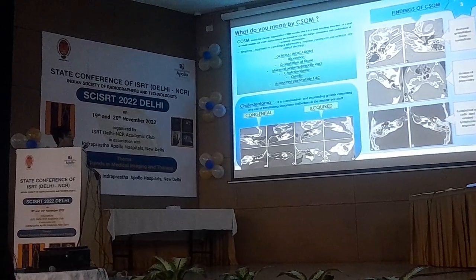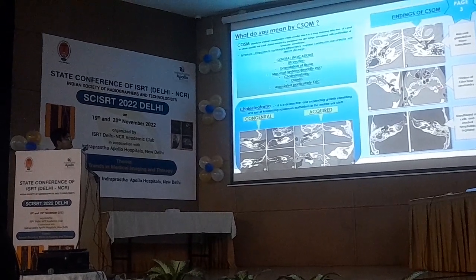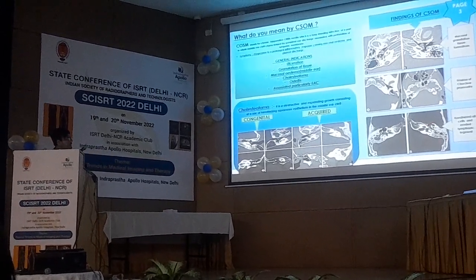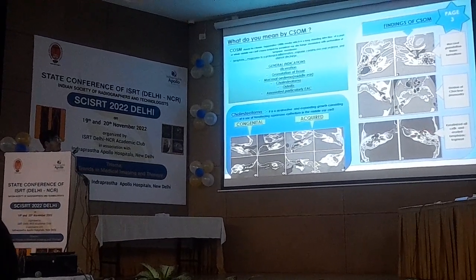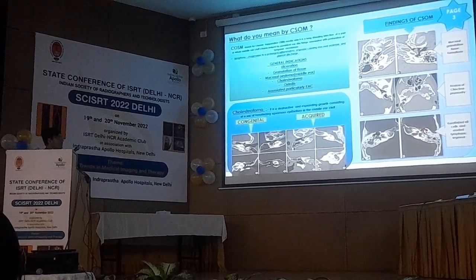And in these images, you can see the erosion in the external ear, and the tegmen tympani is also affected. This is the mesotympanum, and this is the entrance of the aditus ad antrum. This part has an ice cream cone appearance; the incudomalleolar joint of the malleus and the head of the incus, and the short process, get eroded, and that space is totally covered by mucosal granular growth.